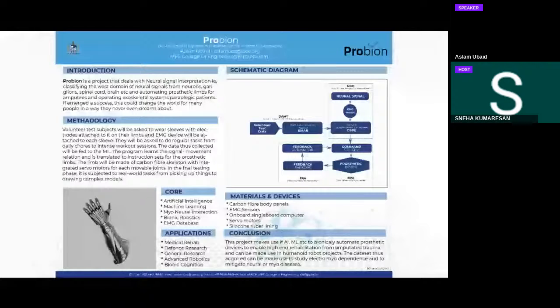We created a system for sensing the muscle and taking the EMG signals overall and correlating both with each other. It takes tens of thousands of training data to be able to make it precise.